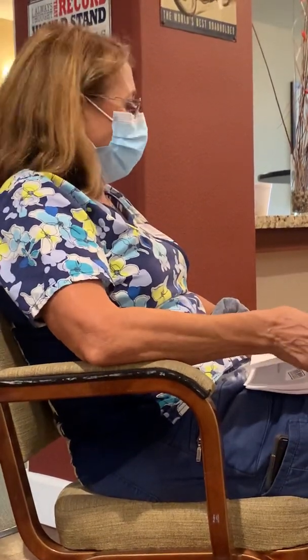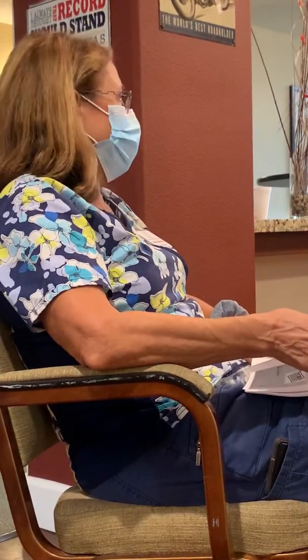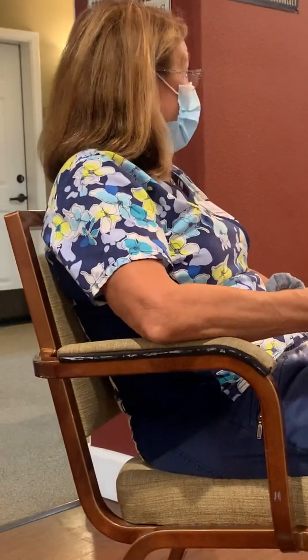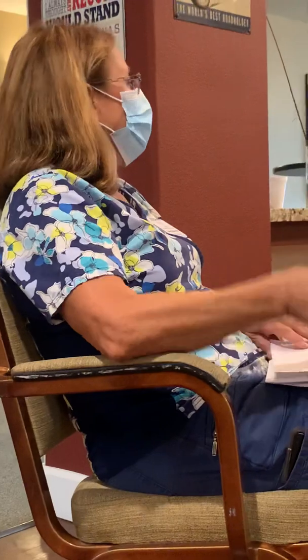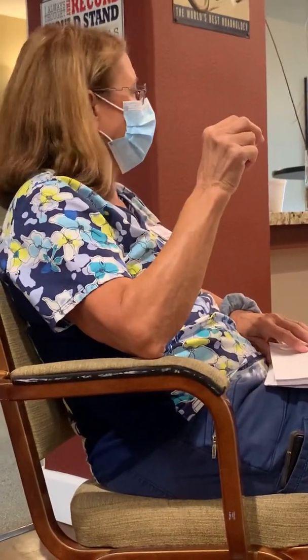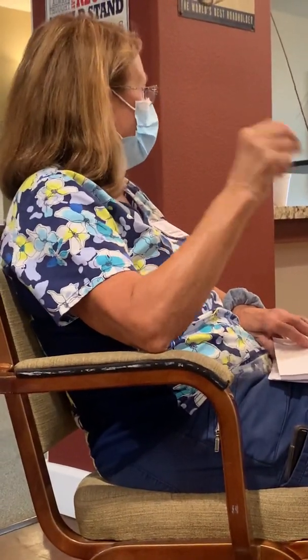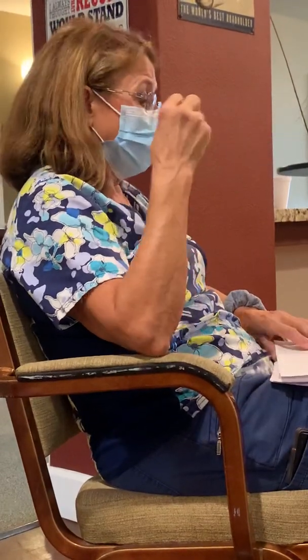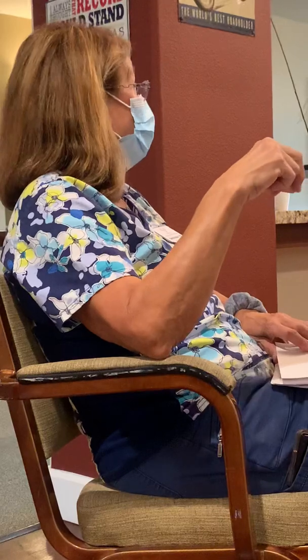We don't recommend intermittent catheterization unless they're having some residual problems. If you do intermittent catheterizations, you're taking a higher chance of introducing infections again. So the whole idea is to make sure that you do not have an infection while the patient's here.